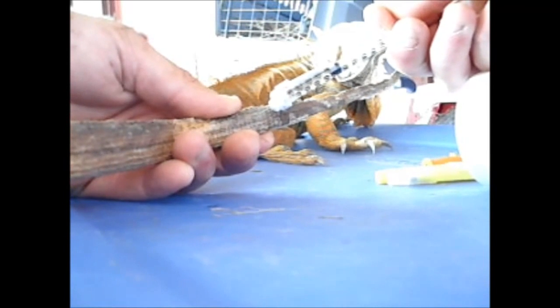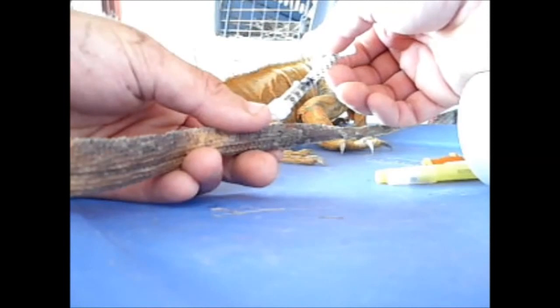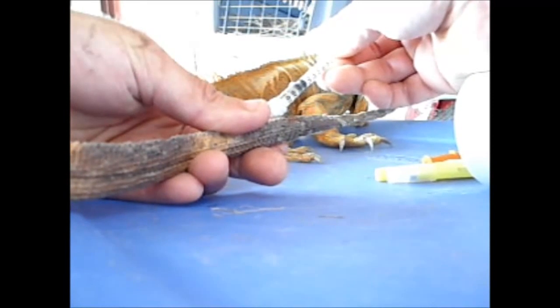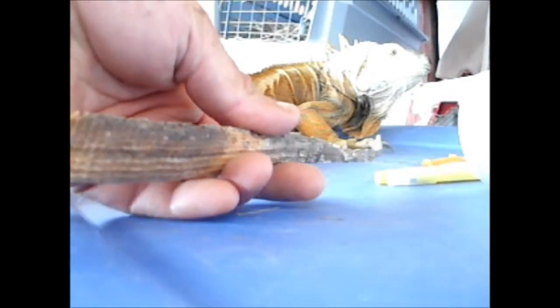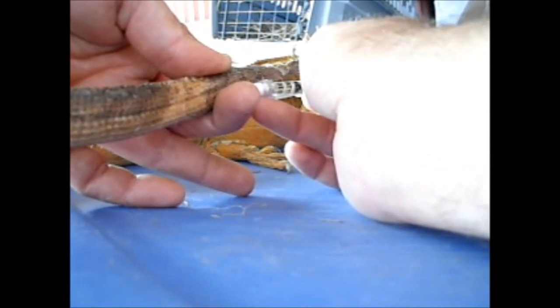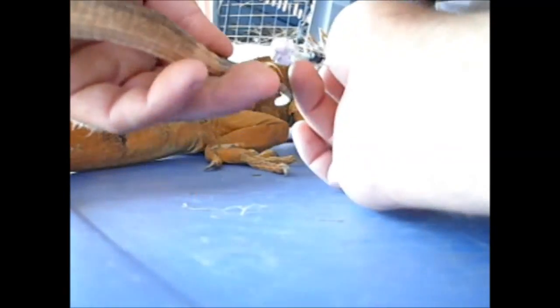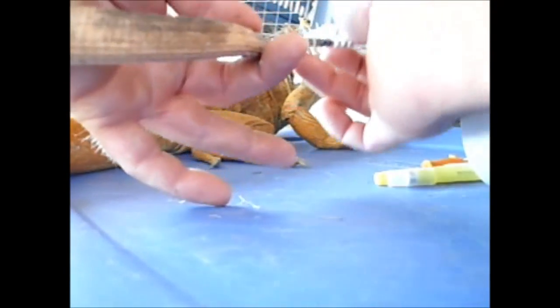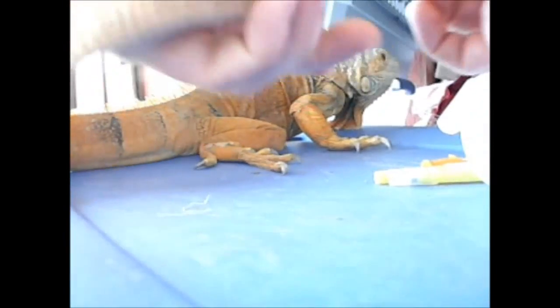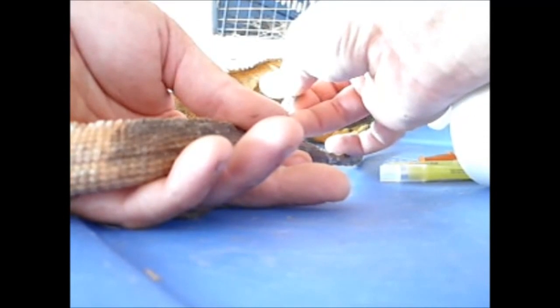And we gotta be sure to take the needle in below the scale. And this will deaden that area up. Of course, it's going to take a second to take effect. So he's resisting a little bit right here, but he's actually being a lot more cooperative than I expected him to be.